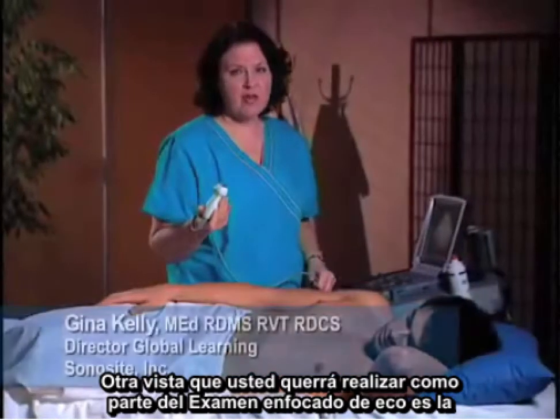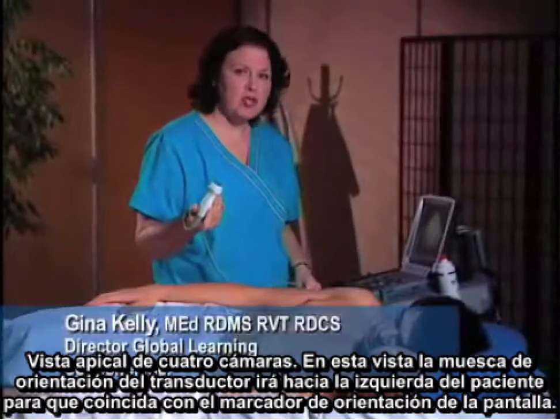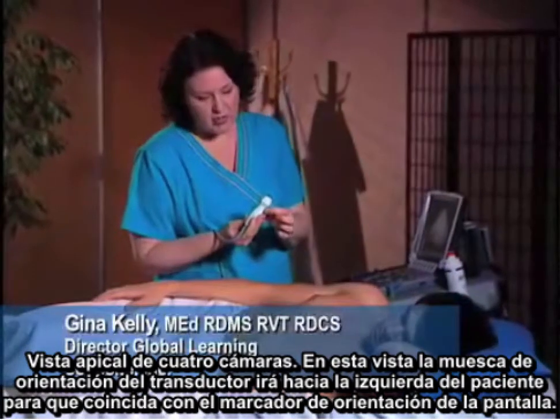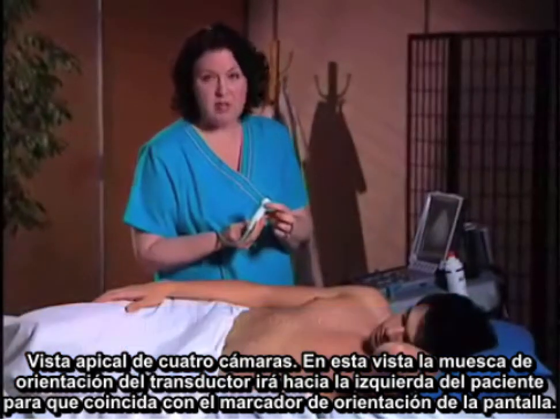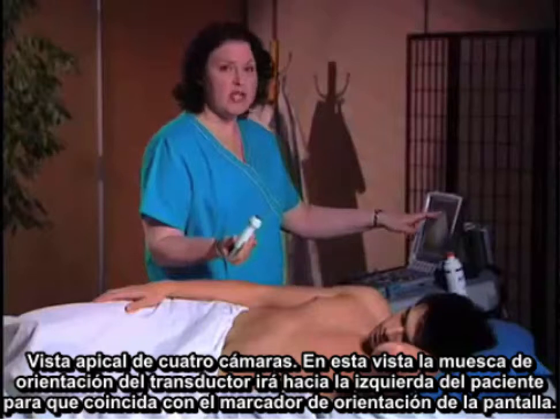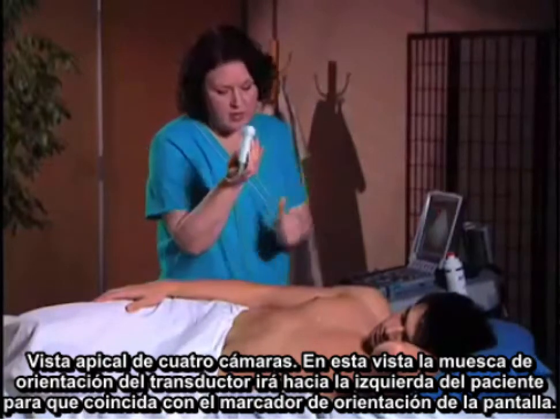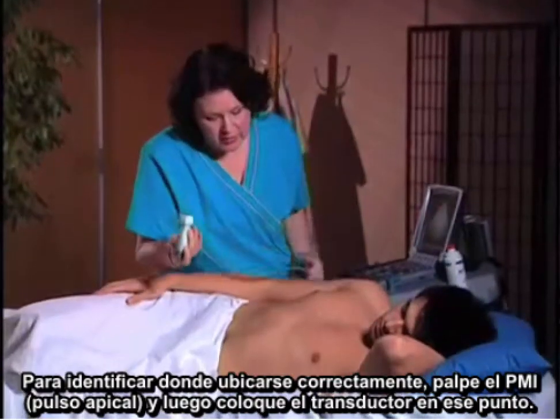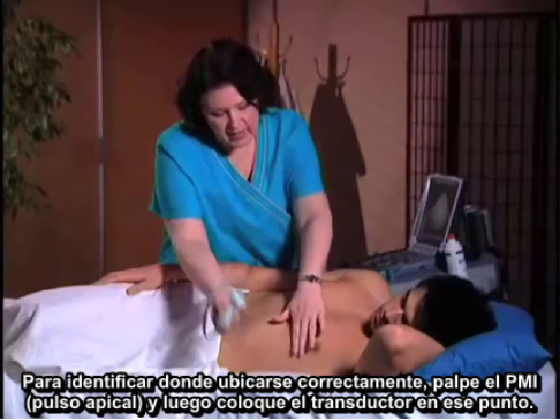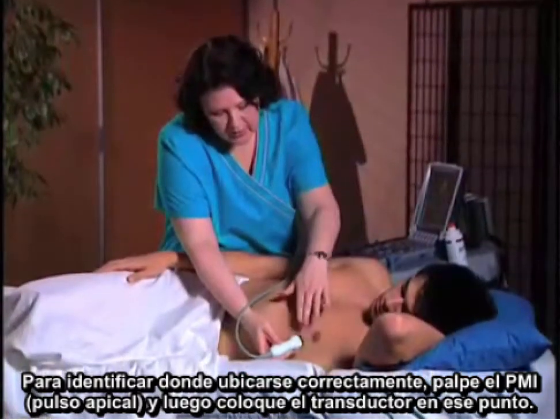The other view that you want to do as part of the focused echo examination is the apical four chamber view, and the orientation marker for this view is going to be to the patient's left, so it actually matches the orientation marker on the screen. To identify where you need to go, palpate for the PMI, and then place the transducer at this point.